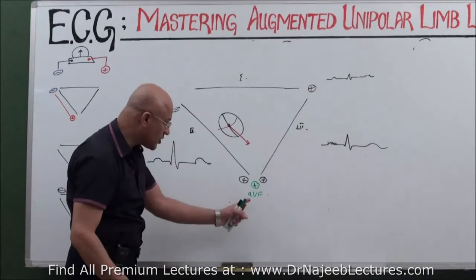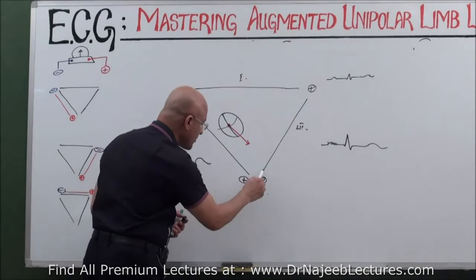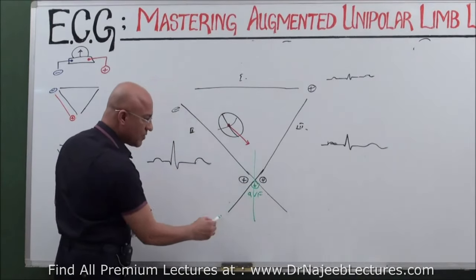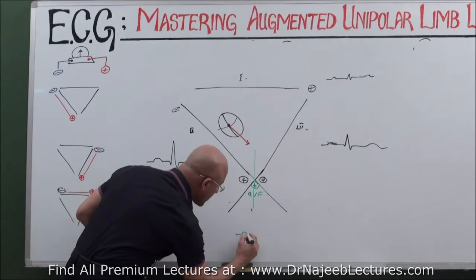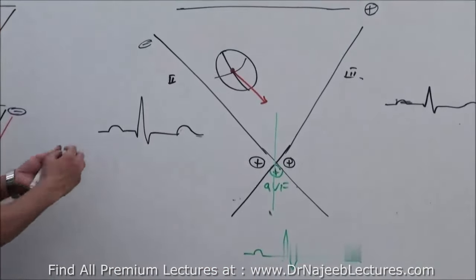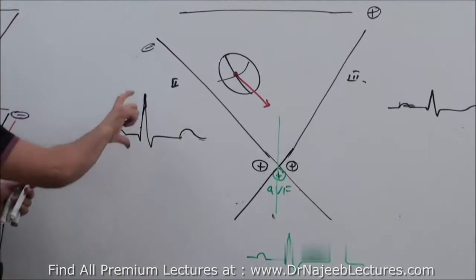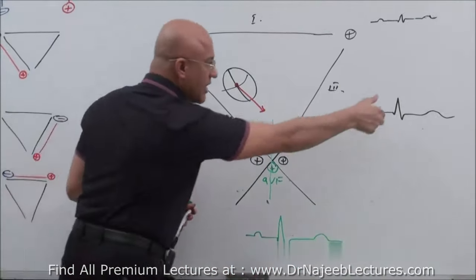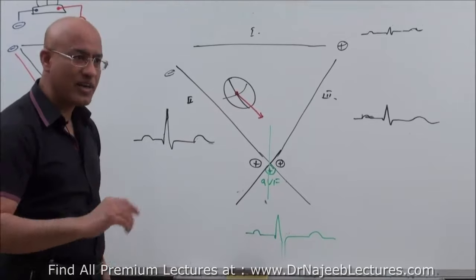You understand why? Because its axis is in between those two. Right? If you extend it like this and like this, AVF will go like that. So it is in between. So the AVF pattern will not be as tall as lead 2, right? If lead 2 is so much, this is smaller than that, but of course, as compared to 3, it is bigger. Am I clear? Now you understand how these leads are helping?